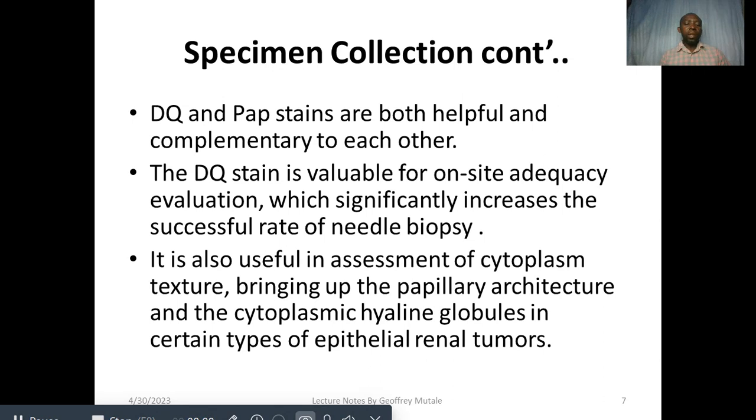So the Diff-Quik stain is valuable for on-site adequacy evaluation, which significantly increases the success rate of needle biopsies, and it is also useful in assessment of cytoplasmic texture, bringing out the papillary architecture and the cytoplasmic hyaline globules in certain types of epithelial renal tumors.